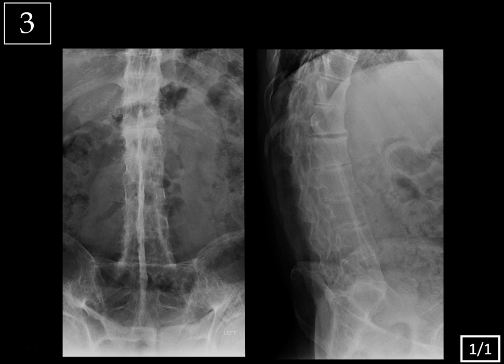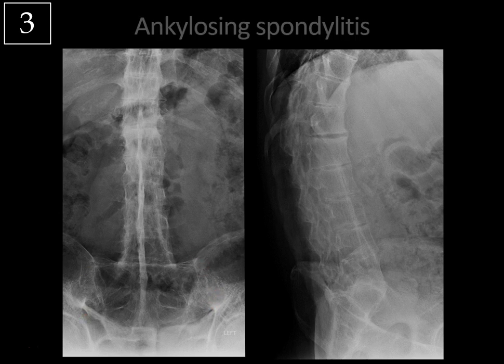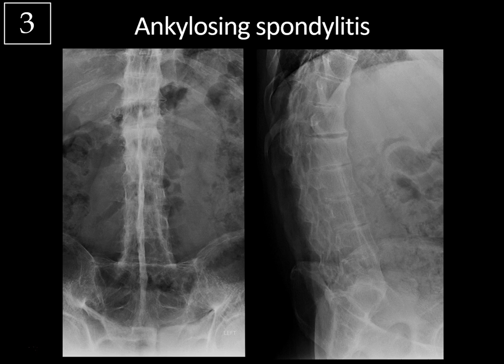Case 3. We have frontal and lateral views of the lumbar spine with two important findings. There is a linear ossification along the midline of the spine, and symmetric fusion of the sacroiliac joints to the point where they're barely detectable. This combination is typical for ankylosing spondylitis — a seronegative spondyloarthropathy, a chronic inflammatory disease of unknown etiology that primarily affects the spine, resulting in fusion or ankylosis of the spine and sacroiliac joints. Usually the first manifestation is sacroiliitis, typically symmetric and bilateral, with initial widening of the joint space followed by ankylosis.